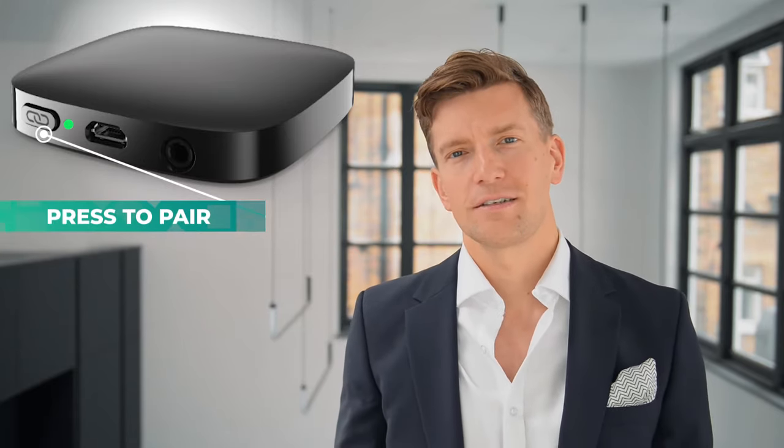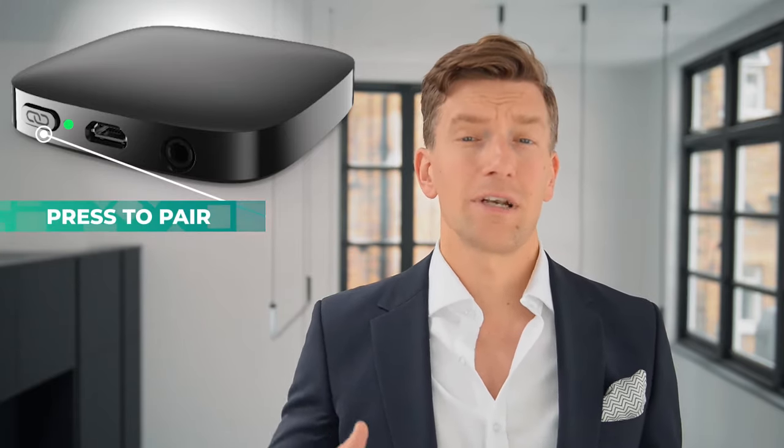Step two: pairing. Pairing to the TV connector is really simple. Now everything is set up, we need to let the hearing aids know that the TV connector exists. The first thing you need to do is gently increase the volume on the television until you see a green light appear on the back of your TV connector. Then press the only button on the back of the TV connector, highlighted here. The LED will now start flashing blue when it's searching for your hearing aids. All you need to do is put the hearing aids within one metre of the TV connector and you should hear a confirmation jingle in your ears. That means everything is set up, paired and ready to go. The LED on the back should stop flashing blue as well now.